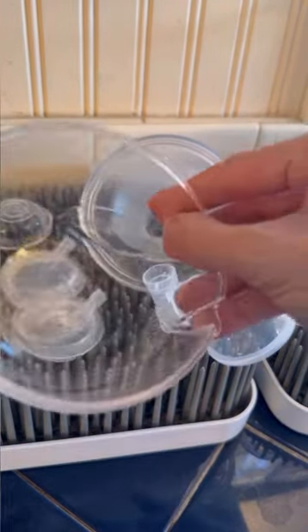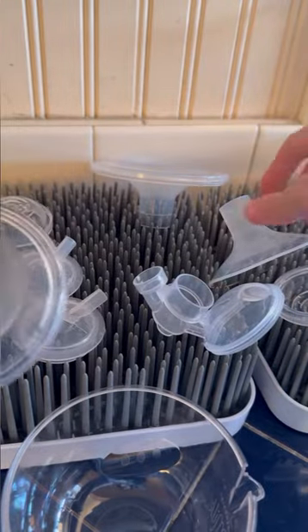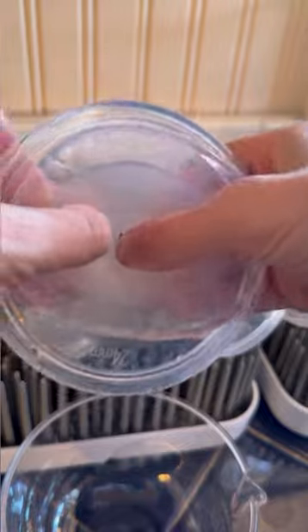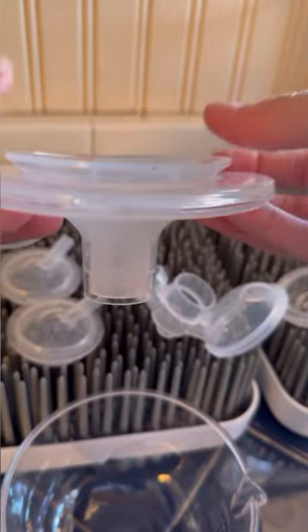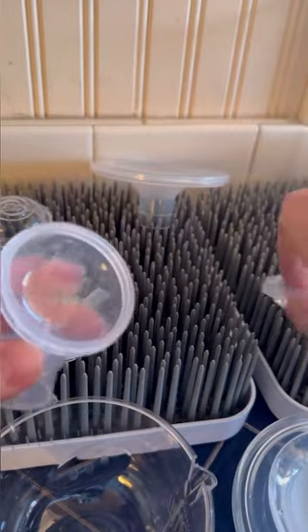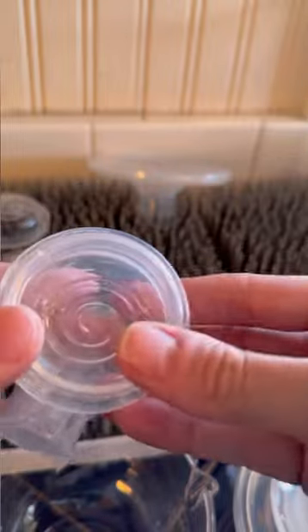You're going to get the cup and put the flange on top, but you also want to make sure you get the right size flange. I got a smaller flange for my nipple size to fit inside of the flange that comes with it. Then you're going to want to get these parts — okay, there we go.